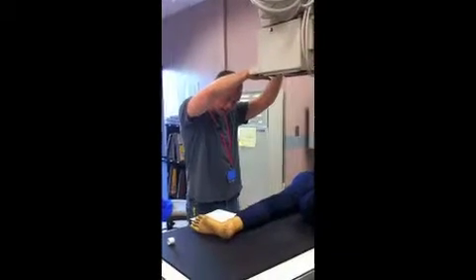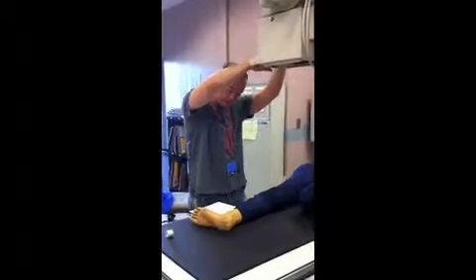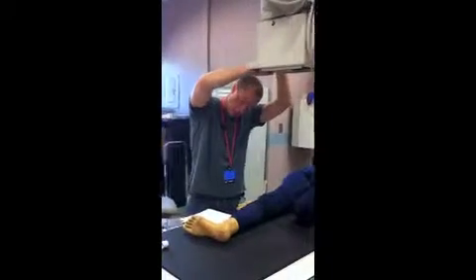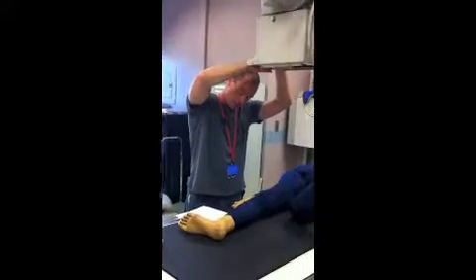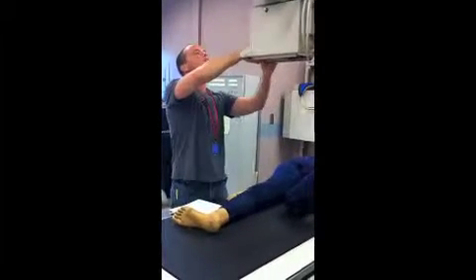The central ray will be perpendicular to the joint space between the patella and the femoral condyles when the joint is perpendicular. And you want the tube angle to be about 15 to 20 degrees.